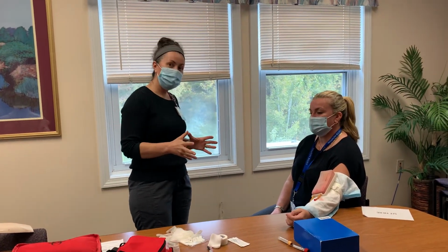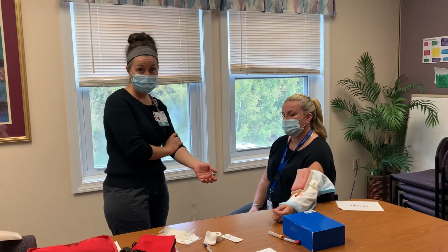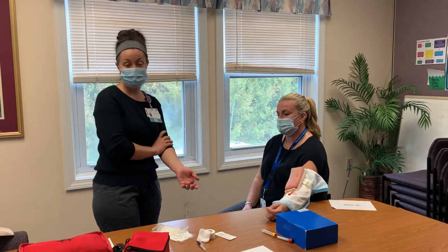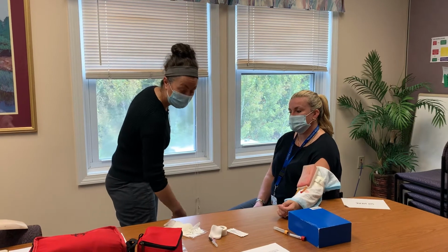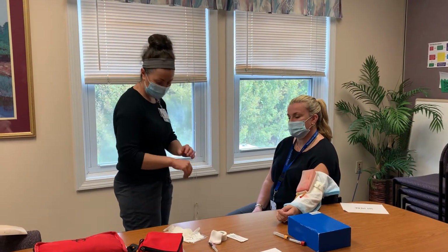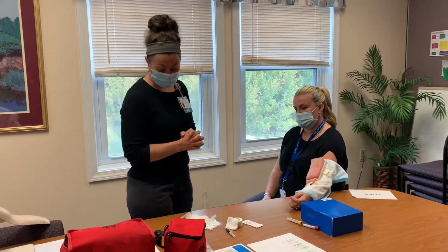The other things you can do if they don't have good access is put a hot pack, a warm cloth, a warm washcloth. If you don't feel anything good, let it sit there for a little bit. Also having them dangle their arm just to help with that blood pooling by gravity. That kind of helps to vasodilate and open up the veins and maybe see something there.